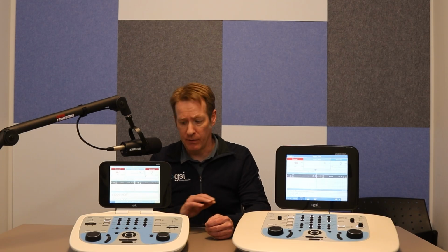My name is Tony Lombardo, and today I'm excited to share with you a little bit about how you can navigate the autoplay options on the AudioStar Pro and the Pello. Now, traditionally, in the past, we've had these options available only through the config app, but now we have the ability to make these changes on the AudioStar Pro or the Pello itself.